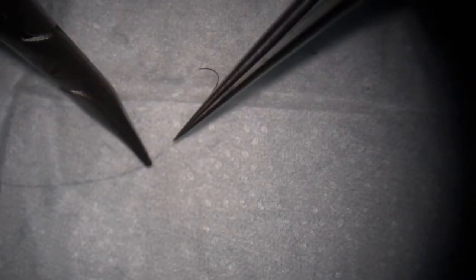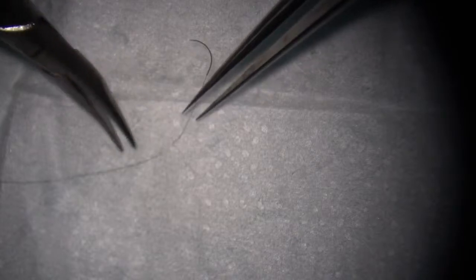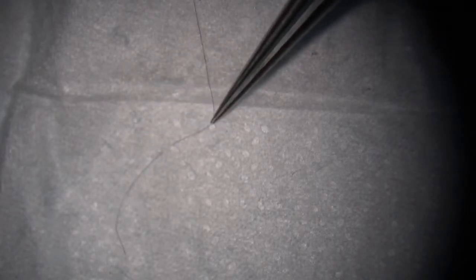Think about this as the edge of the vessel. We want this suture to pass through the vessel straight. We don't want the suture coming out this way, because then we're cutting, wiring the vessel. We tear the vessel. So we want it straight through. So we release the tail to make sure it's straight. If we go this way, we would put one arm up here to make it go straight. Right here. So this part is going straight out.